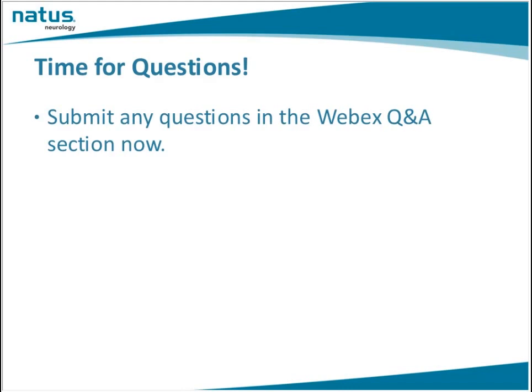They had done them from start to finish, and we had sat down with them and their physicians, and they had interpreted them, and we had critiqued their technique and told them how they could improve. When they went home, they had to send us 25 more studies, and we reviewed them. If we found that they were getting it early on, we'd say you're good to go. Or if we found that some people simply struggled, sometimes we would make a site visit to help them out. So I would say the minimum is 25, the maximum is infinity, but after about 50 studies, you should be feeling pretty good about it.